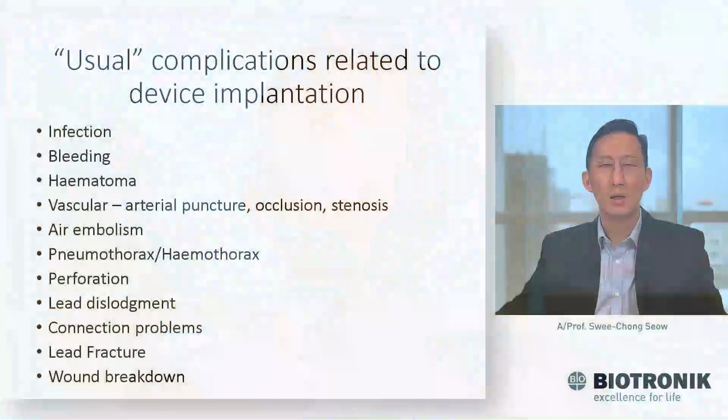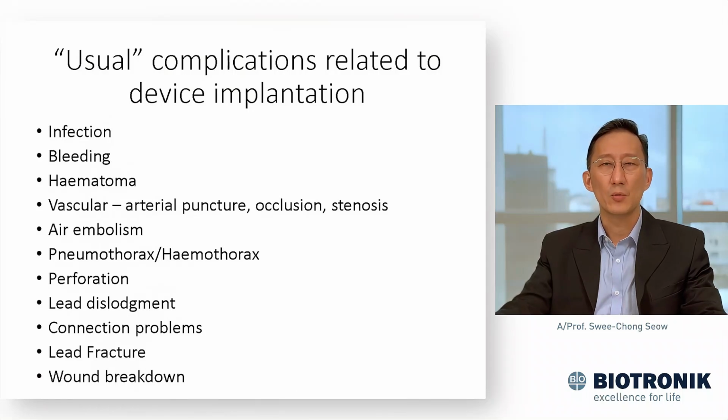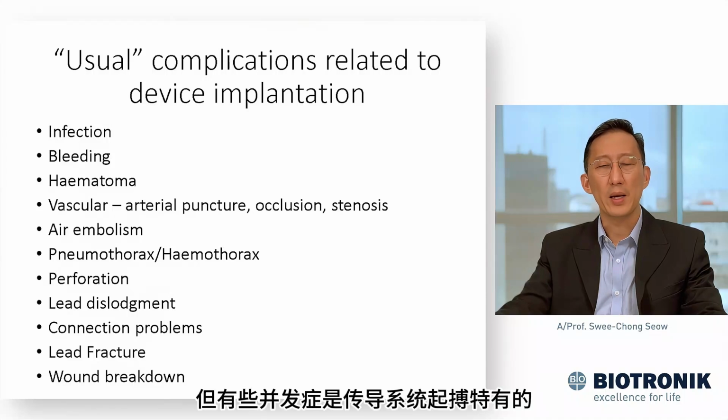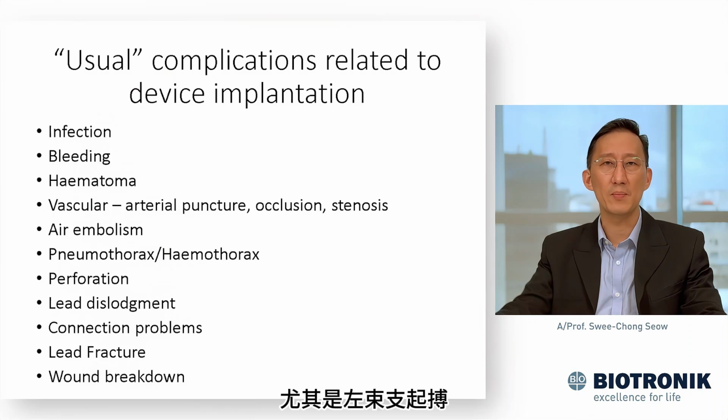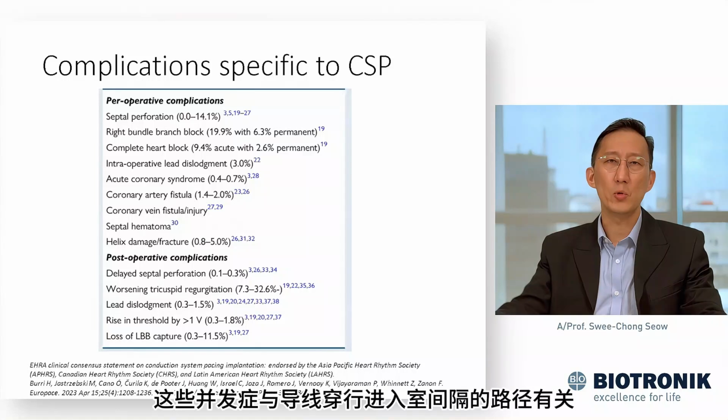Right, welcome back. We're going to be talking now about complications that you may encounter in the course of conduction system pacing. Of course, as with all device implants, you can have these complications, which I will not go into, but there are some complications which are specific to conduction system pacing, and in particular, left bundle branch pacing, that are related to the route taken by the lead as it traverses into the ventricular septum.